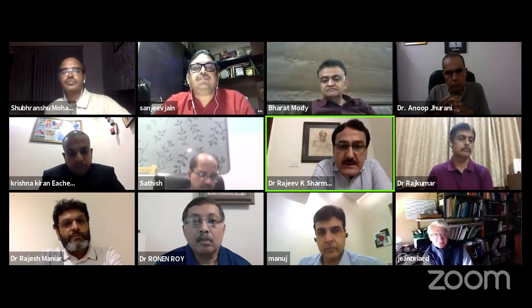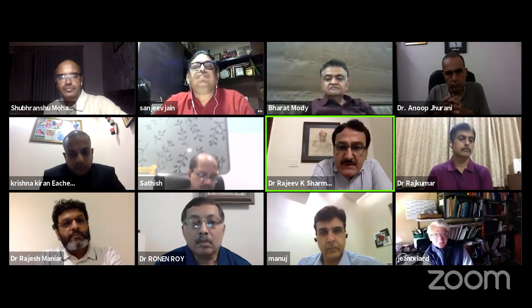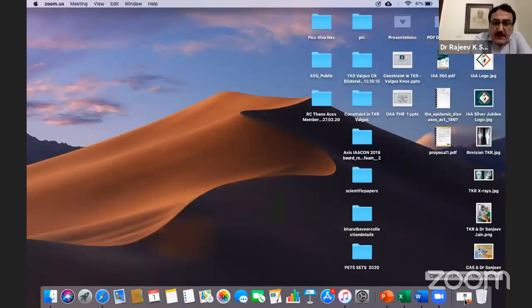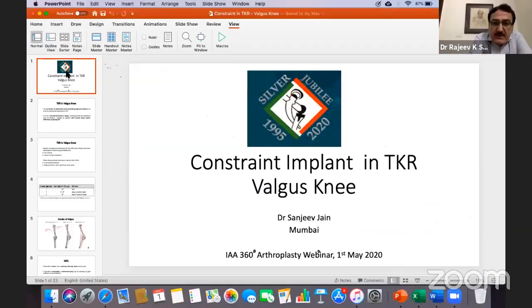Rajesh, I have 2 observations in these cases where you have a dislocated patella. There are 2 things. One is the release that you very rightly mentioned. The second is the rotation, correct rotation, increased rotation of the femoral component. Do you routinely, in these difficult cases, increase the rotation? Which probably is a far bigger help in some of my cases.